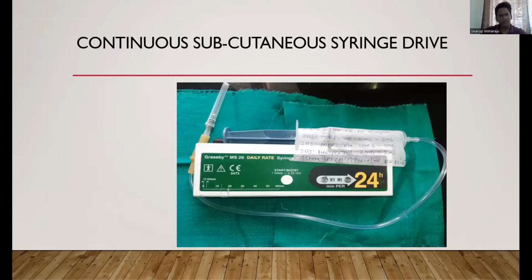Okay, this is how the infusion pump remains. There are a few other infusion pumps which are portable and which can be connected directly to the power supply, or a few can run directly on battery. This is also one of the portable syringe drives which runs on battery, and this can be fixed to the patient's body, not directly to the body, but placed in a pouch with a connector, and it can remain on the patient's body for a while. That means the patient can move around or do his own work.